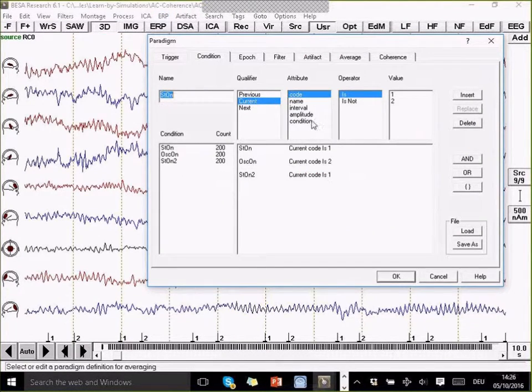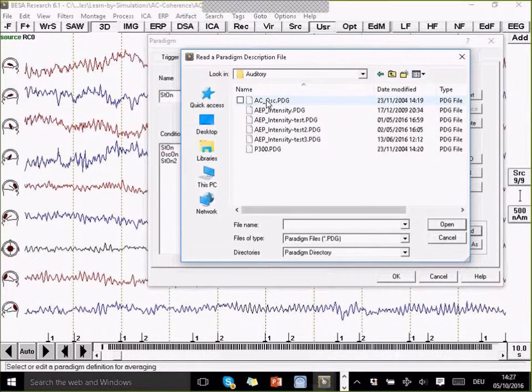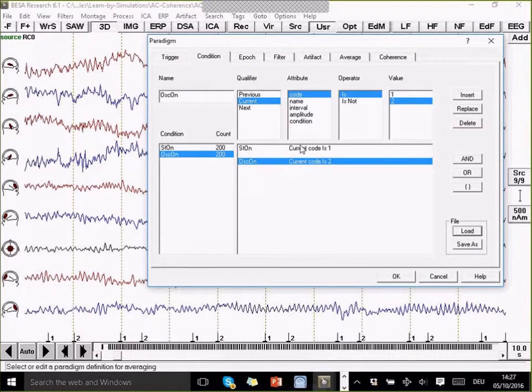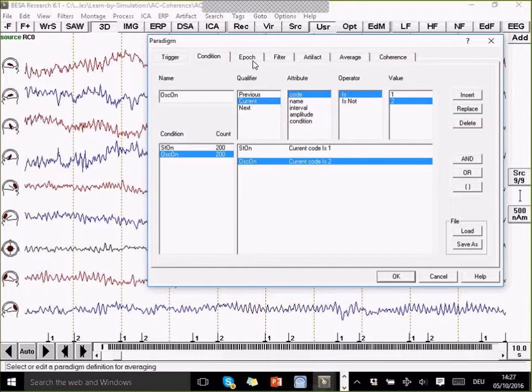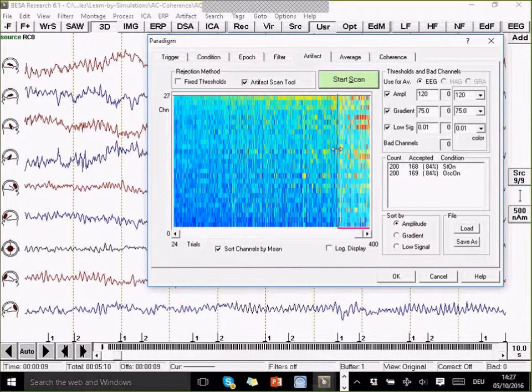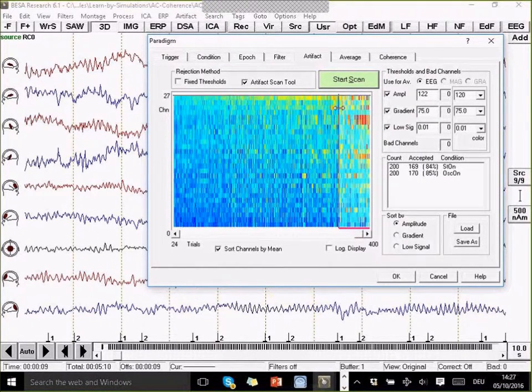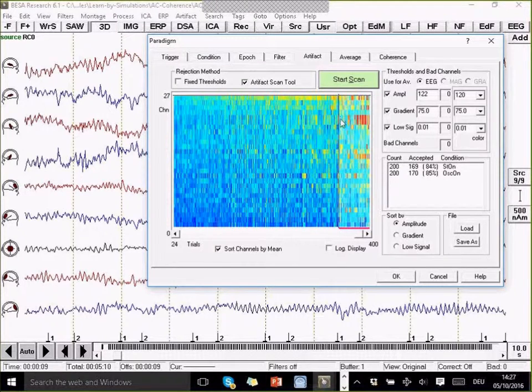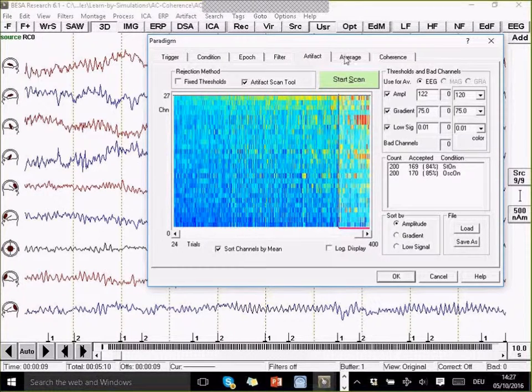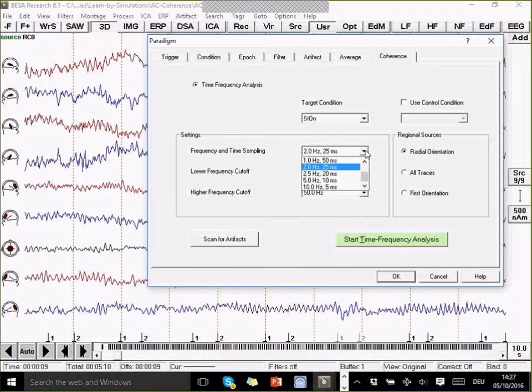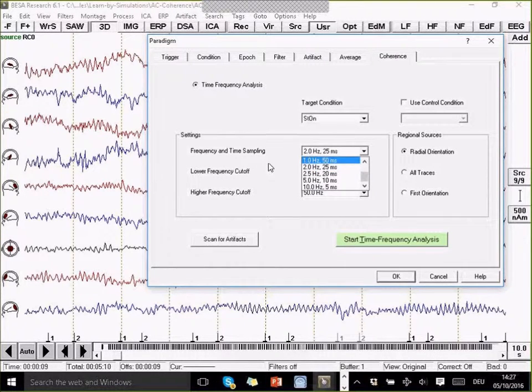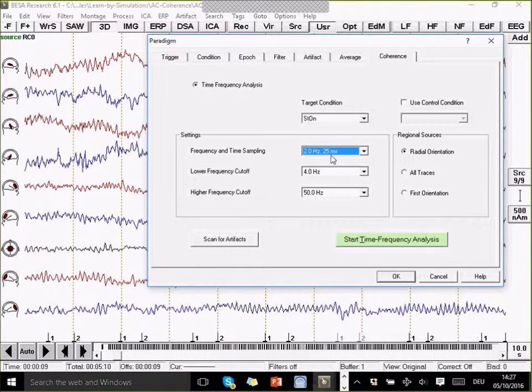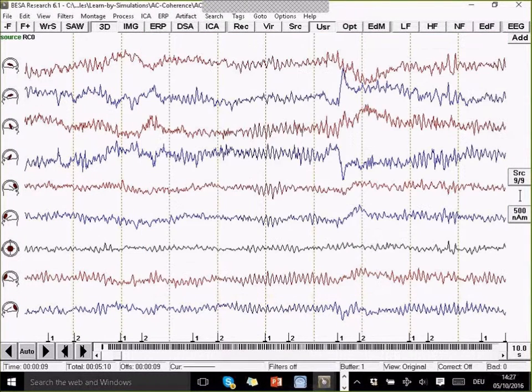I'm going to edit the paradigm. I'm going to load the paradigm actually. The paradigm simply consists of two conditions with averaging the code number one, number two. I can perform an artifact scan to get rid of any eye blinks and other electrode artifacts. I can change the number of accepted trials here. I've got 84% accepted trials. Then I go over to the coherence tab. Here I can get a trade-off between my time resolution and my frequency resolution in the time-frequency decomposition. The two hertz and 25 milliseconds sampling is kind of a trade-off between best time and best frequency resolution. I'm going to work with that and start the time-frequency analysis.